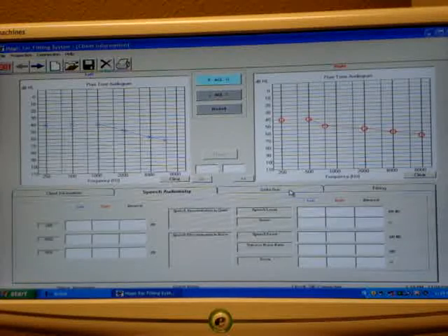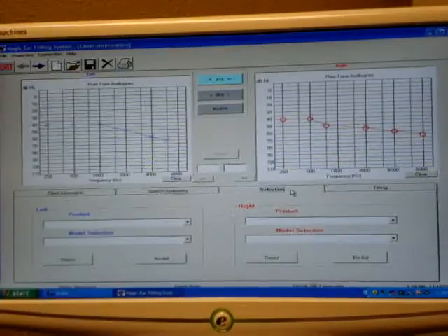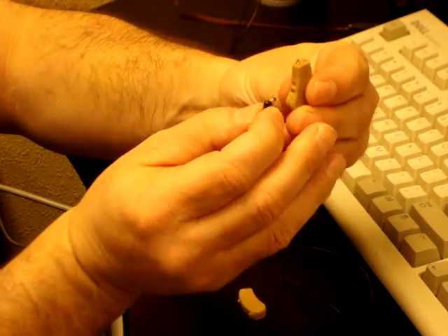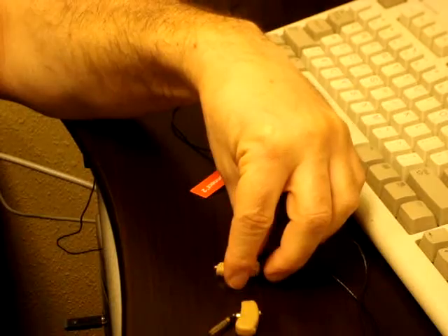Click the Selection tab. Connect the hearing aid, matching the red dot to the red dot on the programming socket, left and right sides.